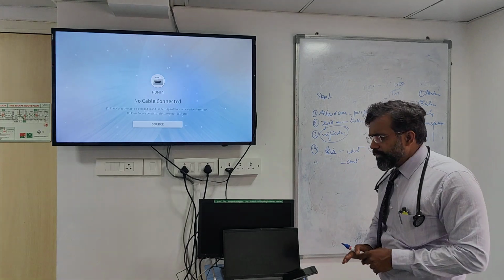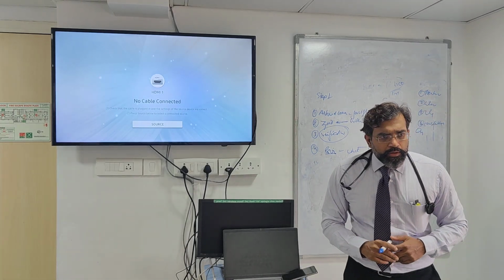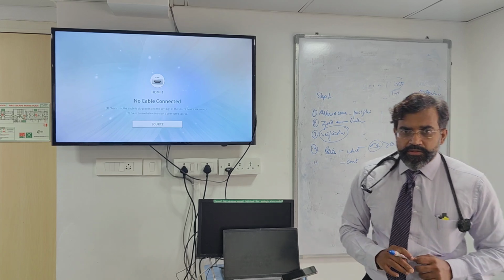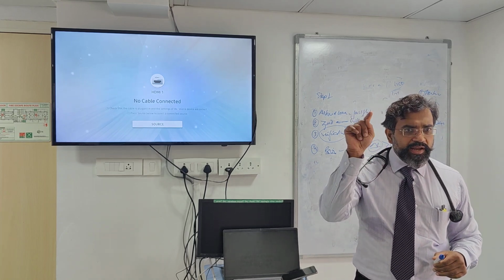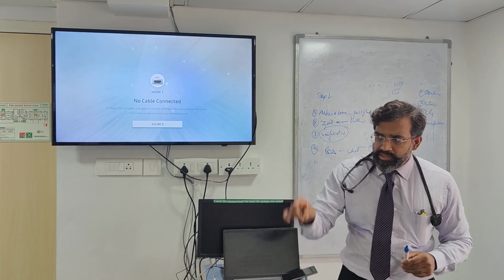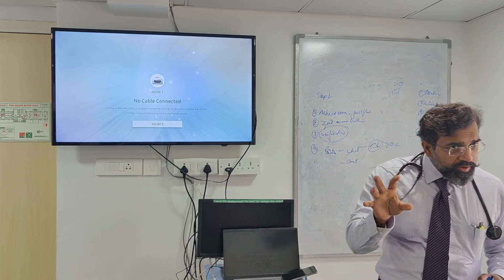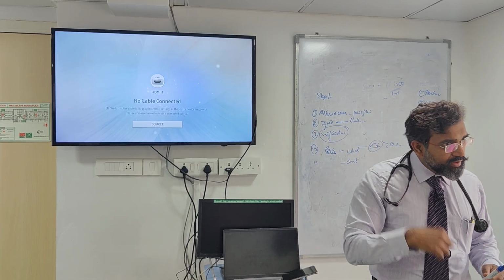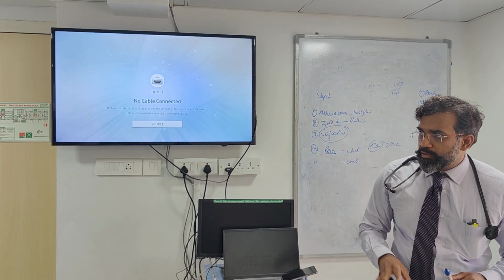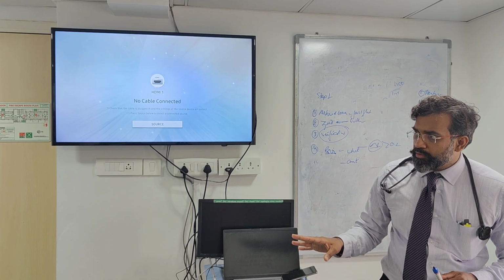Now the amount. What is the amount of fluid? So whatever your intake, you put it as an input when you are actually doing cardiac output monitoring. There is an input. So that input will be 15 ml, say for example. If you have injected 20 ml, you put 20 ml.